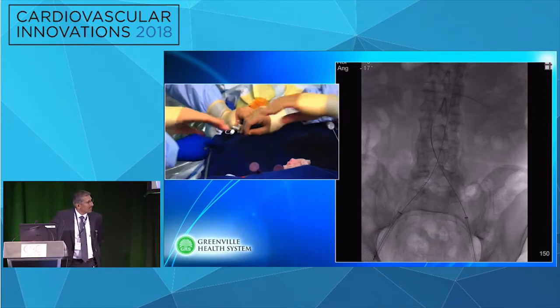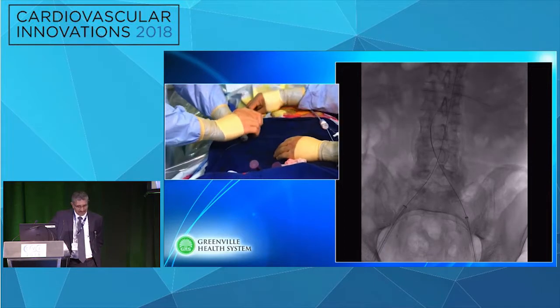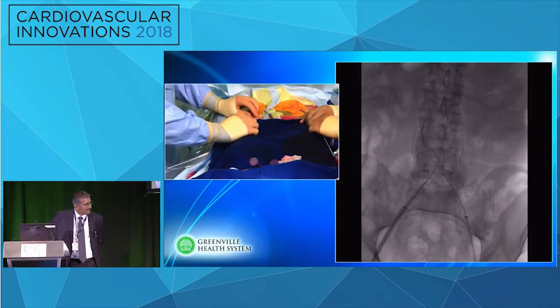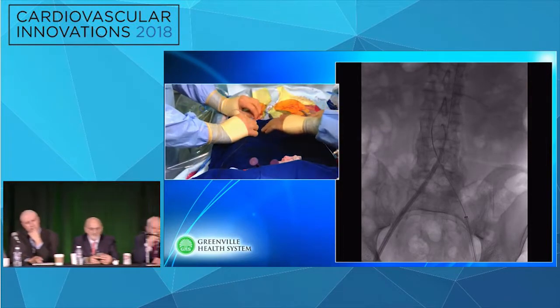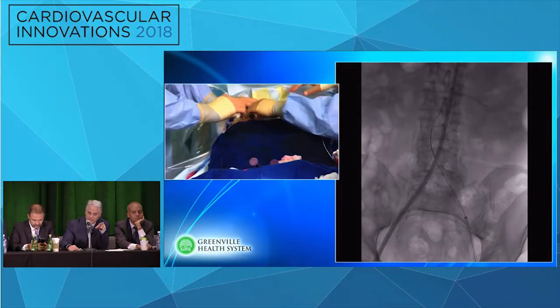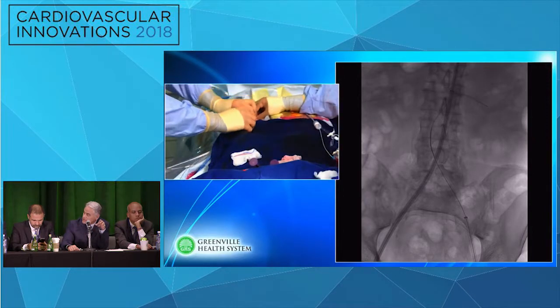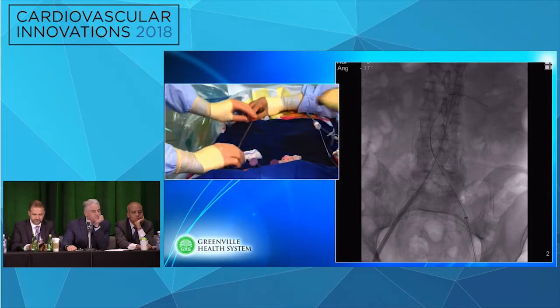One of the other interesting things about this case is, you saw that the distal aortic bifurcation was pretty tight. And that can certainly be problematic depending upon the specific type of graft that you're using. So some operators, for example, if it's tight at this bifurcation, will like to use an AFX Endologix graft because it saves a little bit of room in there, and you do not have competition between the two limbs.